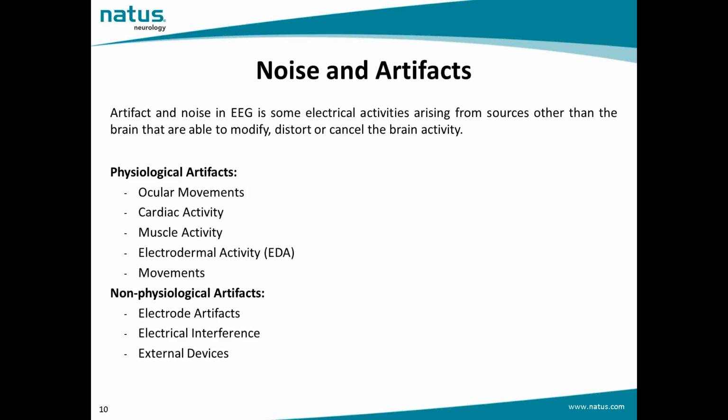Sometimes artifacts that occur during the recording are very clear, and so we are able to distinguish them from the background EEG activity, avoiding taking them into consideration and interpreting the EEG activity properly. Many other times, unfortunately, artifacts appear very similar to the EEG signal, and they could simulate some abnormal EEG activities, so they could lead the doctors to interpret the EEG wrongly.